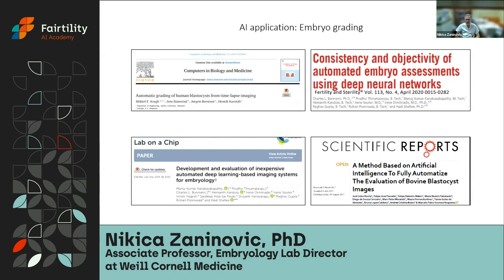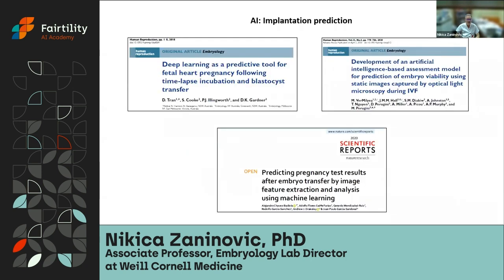There are numerous papers in recent years that are trying to apply AI even for embryo grading, for cleavage stage embryos or blastocyst stage embryos. So that's one of the applications. And they're also trying to predict implantation.